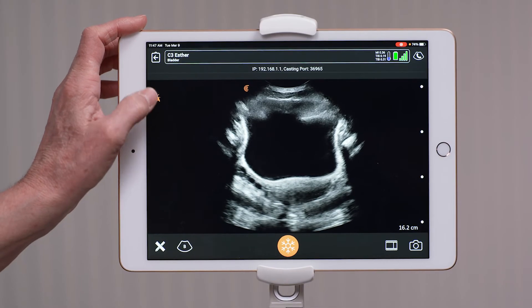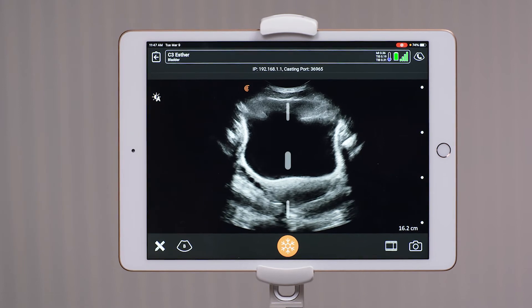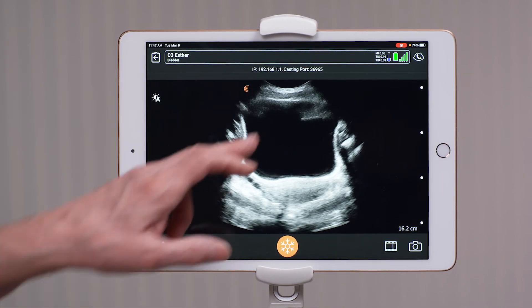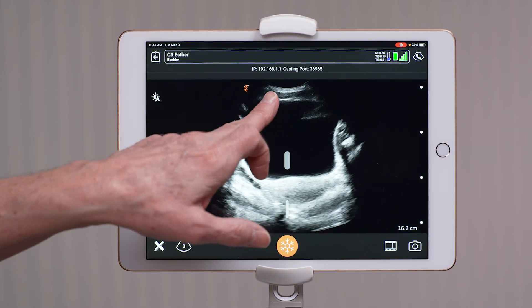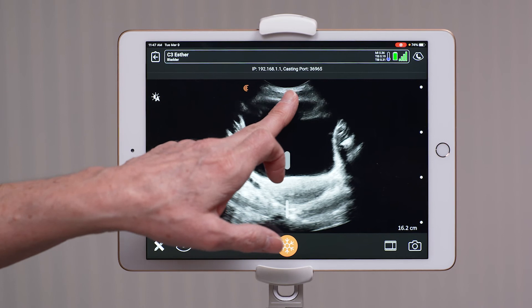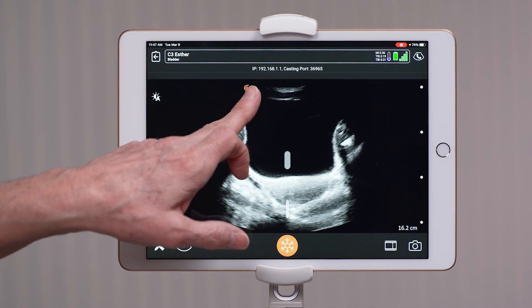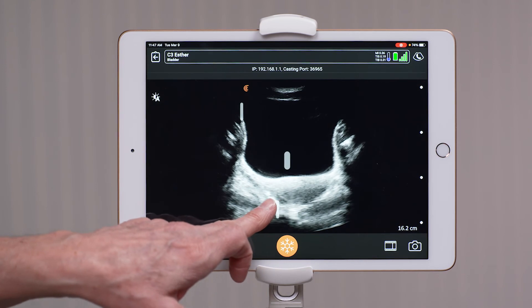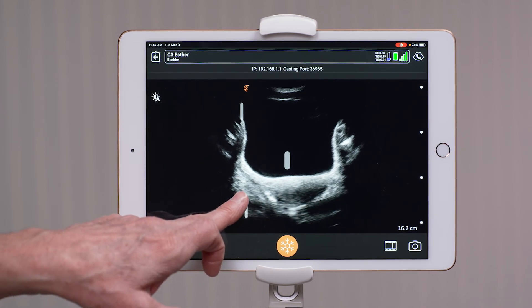To turn off the auto gain, you press the A in the sun to the left, you turn it off, and now you'll have your time gain compensation curve. To adjust the near field gain, you can swipe right and left, but to eliminate the near field artifact, swipe to the left, as well as swipe to the left in the far field to eliminate far field enhancement.